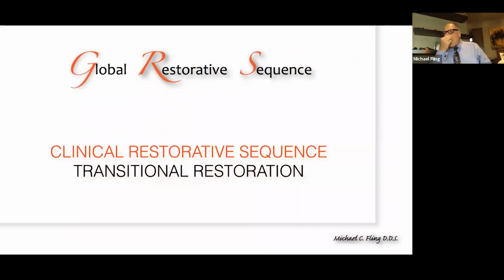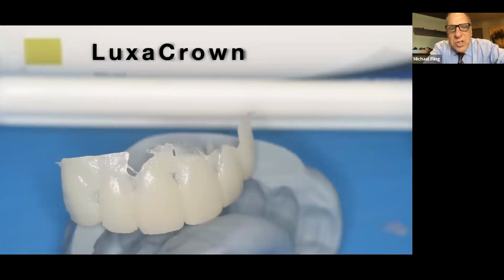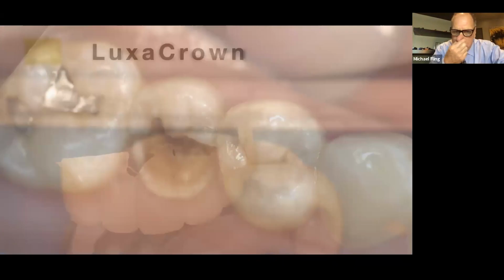Now, in the last 10 to 15 minutes, I want to show you how I have now turned this into a technique that makes so dadgum much sense to me. It really kind of rocks my world. I really love this. And I call these transitional restorations. I use Luxa Crown a lot for these because Luxa Crown is a bisacryl material that has got more strength. In Europe, they actually use this as a permanent restorative material.